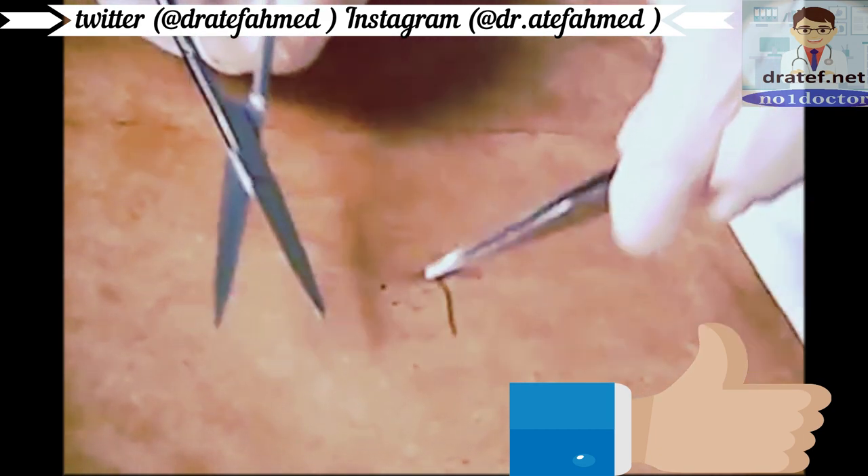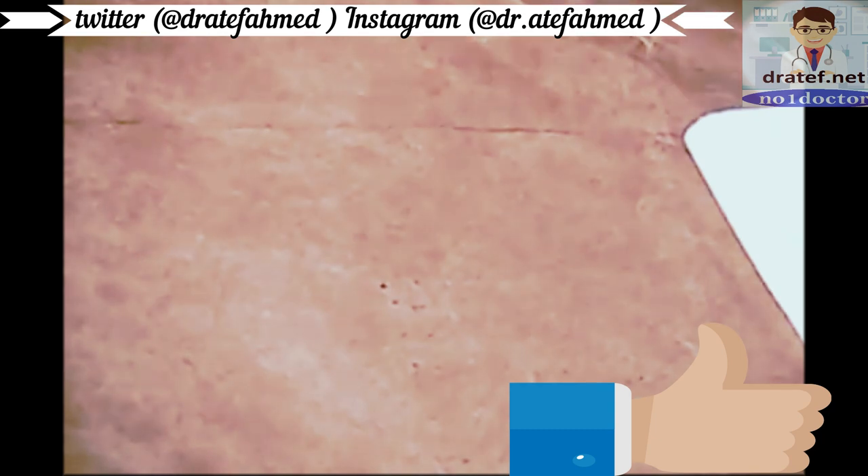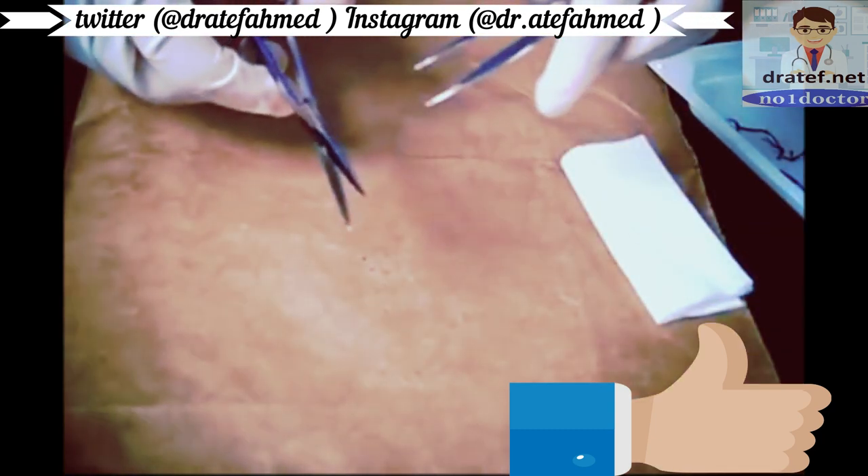It's really easy when your patient has four sutures — a little bit of a different story when they have twenty.